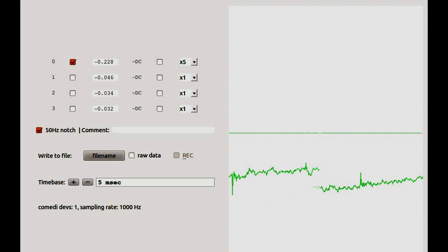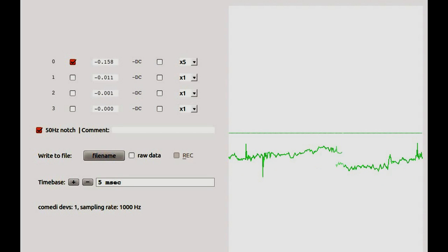And the signal that I can see on the screen, is that my EEG now? Well, it could be your EEG, but the problem with EEG is that there's other signals that we could be recording as well. So things like EMG, which is your muscle activity and your eye movements and movement of the leads in the amplifier as well. Right, okay. So we can demonstrate this by looking at these individually.